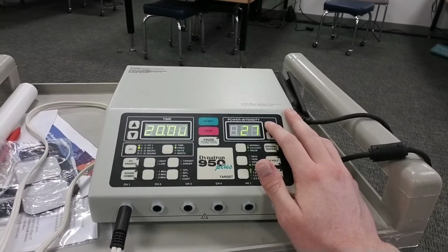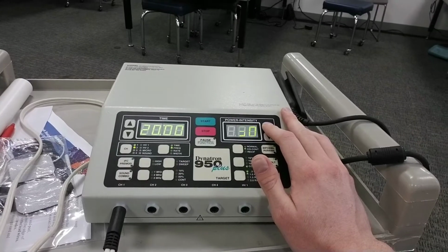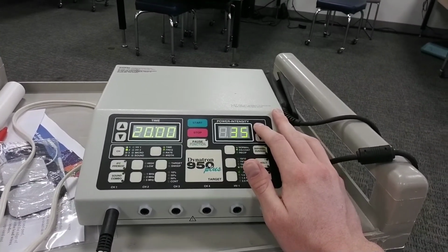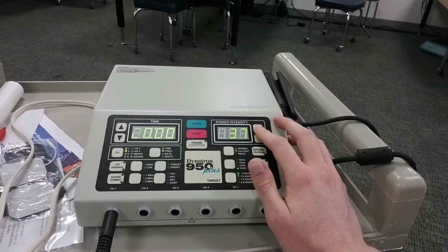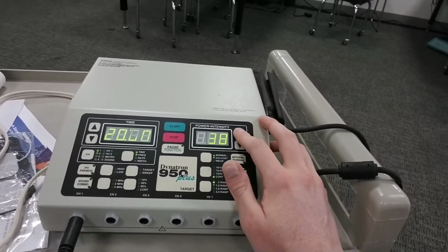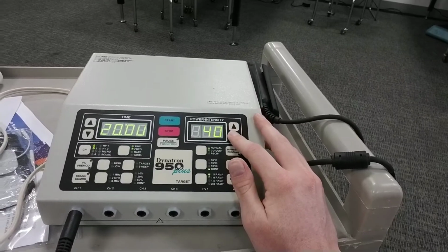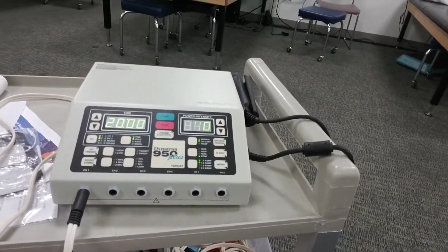Okay, great. You let me know when it gets to the strong but comfortable tingle. If it gets to pain, we'll back off a little bit and go from there, okay? About right there, a nice tingle. Right there? Mm-hmm. If I go any more, it'll be painful. We can probably do a couple more if you want. Yeah, right about there? Mm-hmm. Okay, awesome.